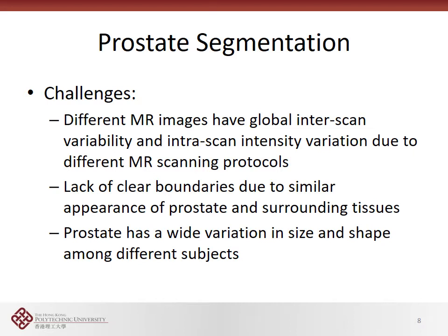The second application is prostate segmentation. Segment prostate from 3D MR images. It is also a very challenging task for the following reasons. First, different MR images have global inter-scan variability and intra-scan intensity variation due to different MR scanning protocols.